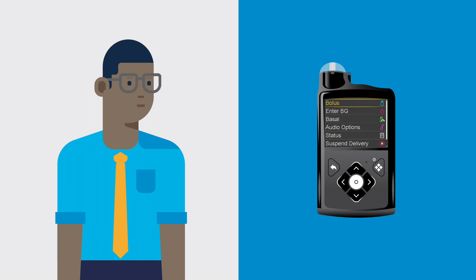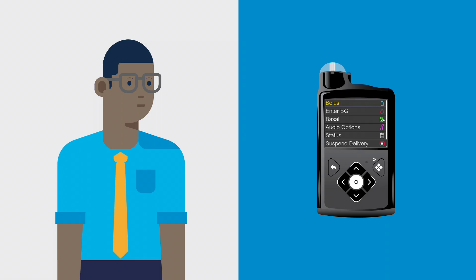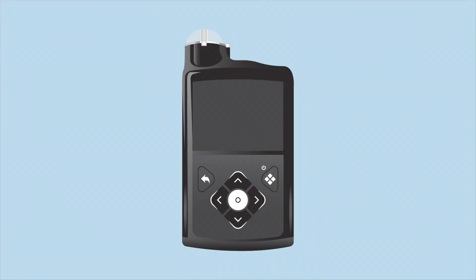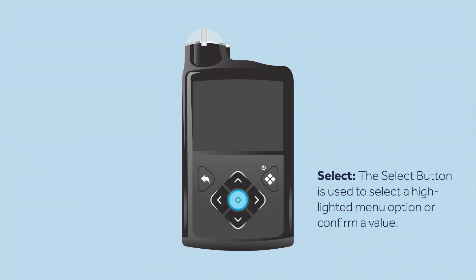The pump displays information on a screen and can be controlled by the buttons on the front. Nick explains each button performs a specific function. Use the arrows to scroll through a menu or to change a value on the screen. The select button is used to choose a highlighted menu option or confirm a value.